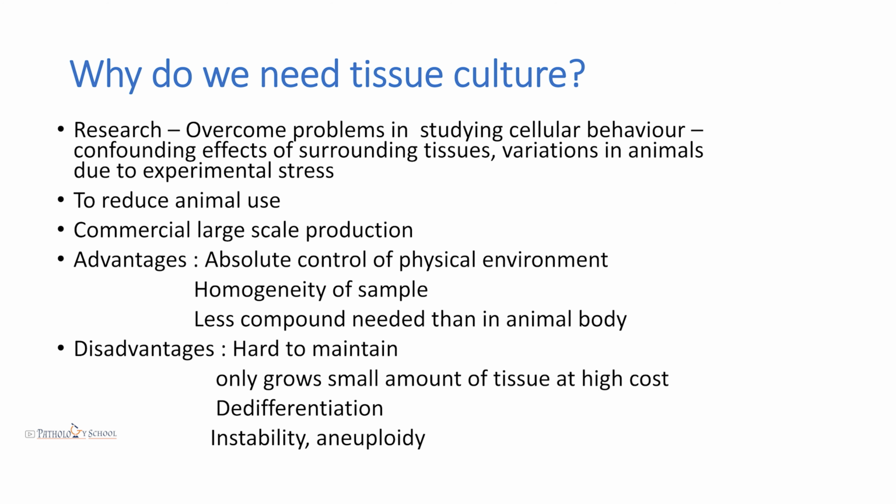Now the advantages were we had absolute control of the physical environment. There was homogeneity of the sample, and less amount of tissue was needed to produce more. Less compound was used and more results were seen.